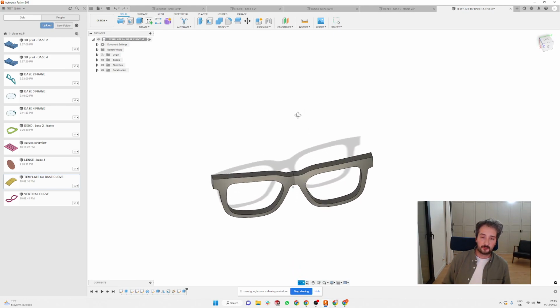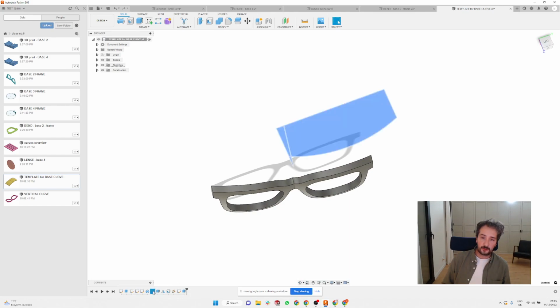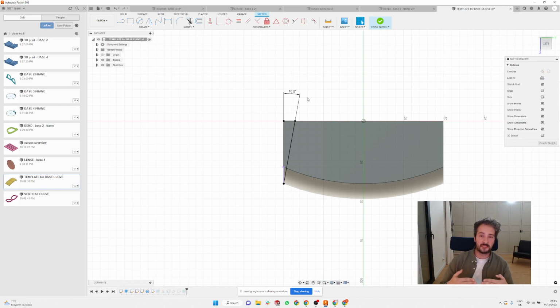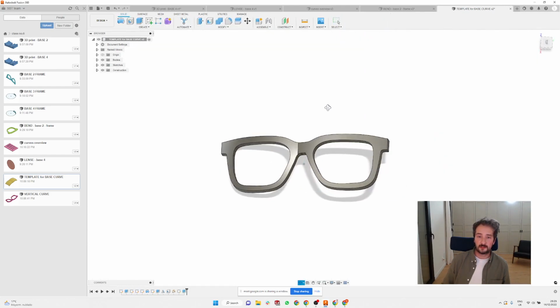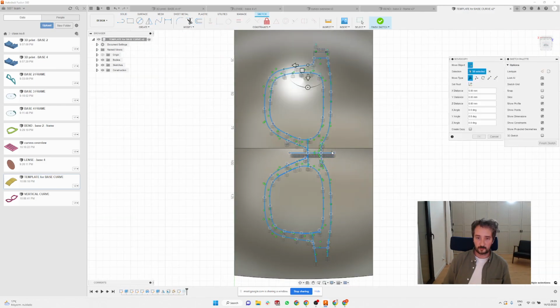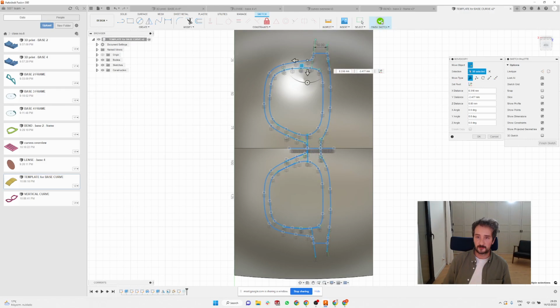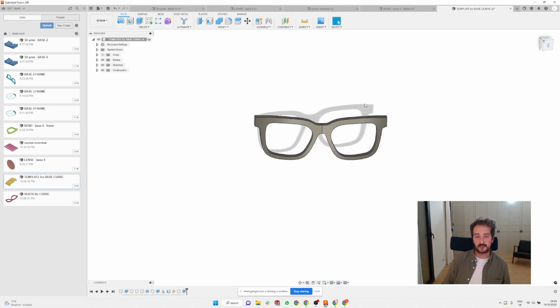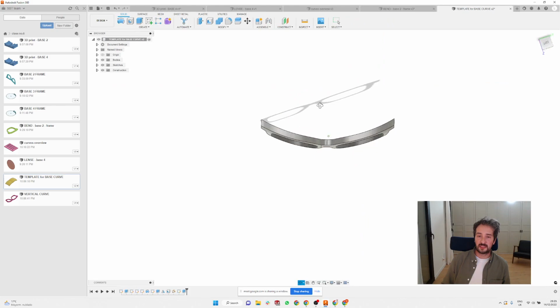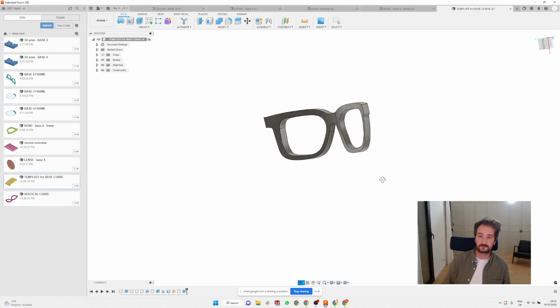There's a way, I think this one I designed with the base 2, but if you go into the sketch again, here I select the 10 degrees bend between those two lenses, but I can do, let's say, 15 degrees here, and you can see the frame is even more bent now. So you can play with these angles. I'm gonna move this again to the center. And it's more bent. If I go maximum up to 22 degrees in this angle, you can see that it's almost a perfect radius. So it means I'm getting very, very close to base 4 because it's matching the cylindric curve on the lenses.